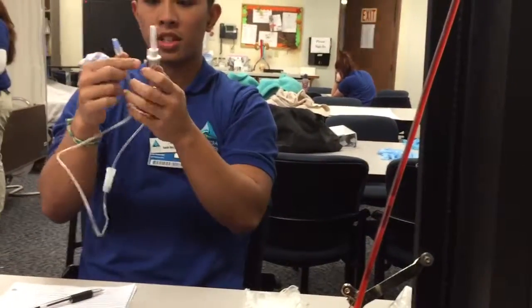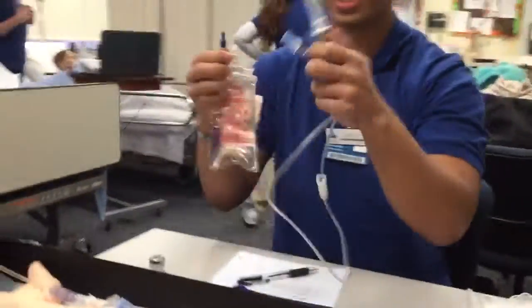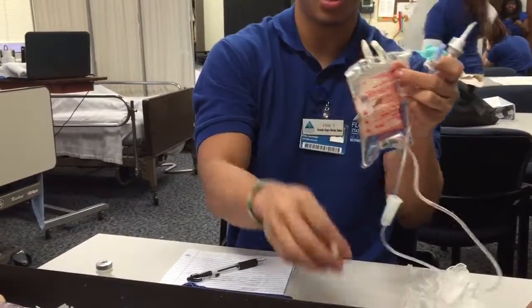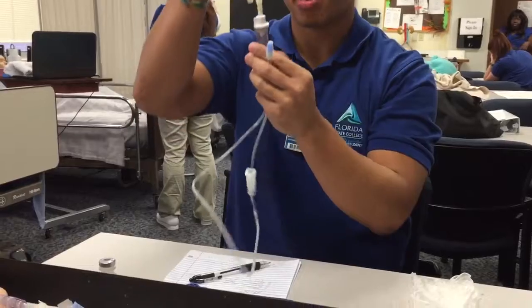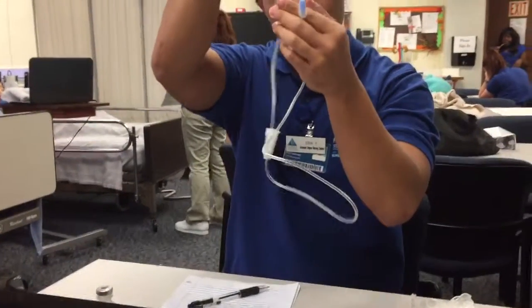These are both sterile tips because they both have caps on them. I'm going to spike our bag, and it's already clamped. I'm going to take this off, being careful not to touch that. I'm going to take the tip off of that, making sure they don't touch. I'm going to spike the bag, just like that. I'm going to turn it over and prime my tubing until it reaches the line, which is good right there.